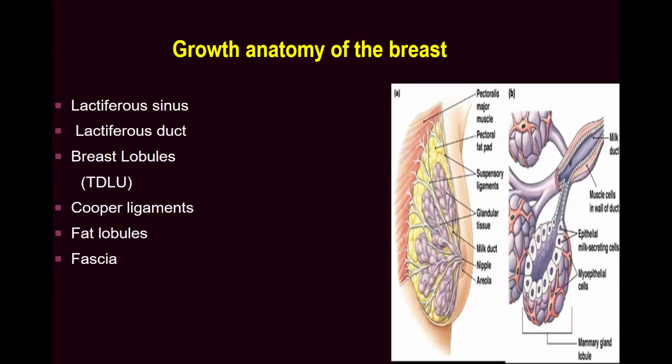Since we are still talking about breast anatomy on ultrasound, we need to keep going through these slides to remind ourselves about breast composition.